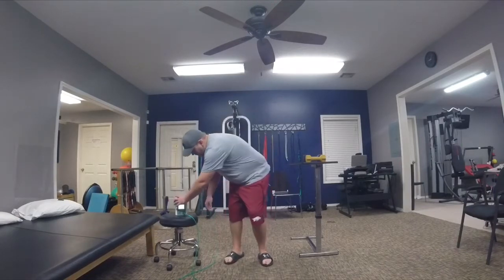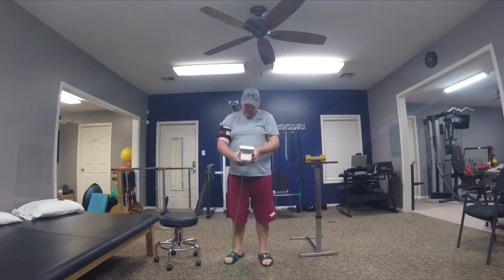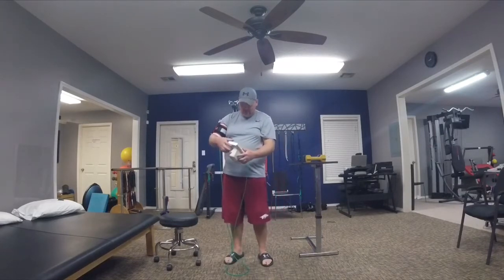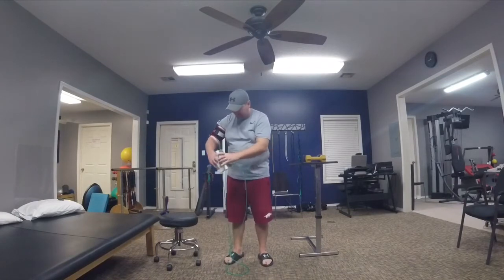Okay, so what the machine is telling me is that 80%, which would be my legs, would be 120. So we're going to drop this down to 50%, which is the protocol for upper extremity, which is 77 millimeters of mercury. So what I'm going to do now is we're going to set this machine down. Actually, I'm going to inflate it to my 77.